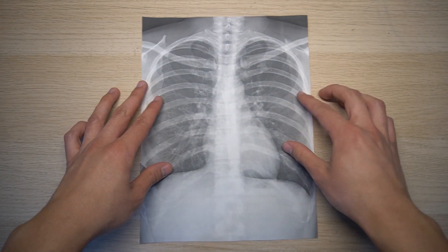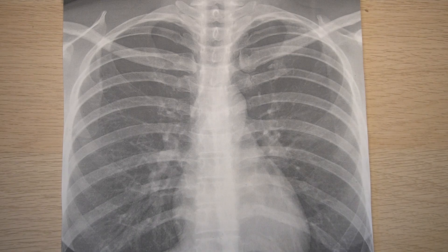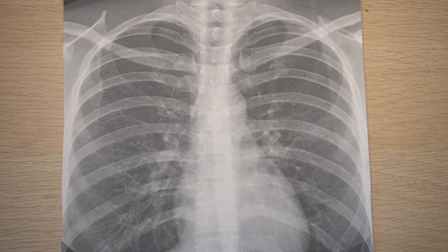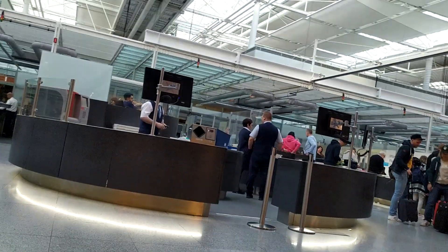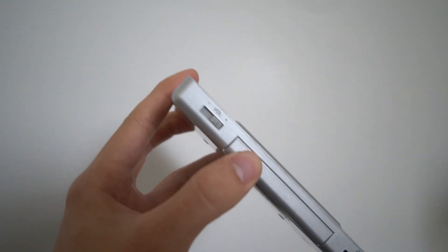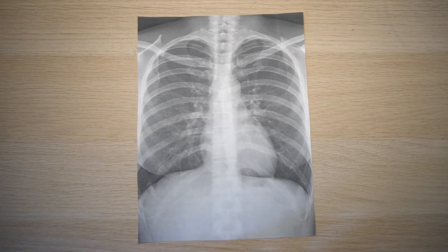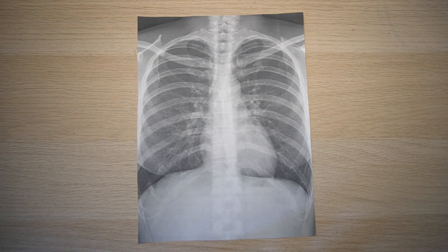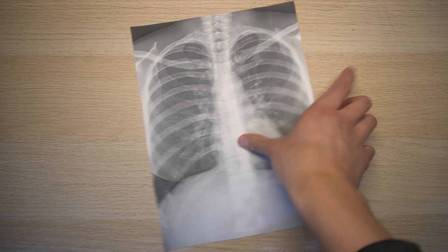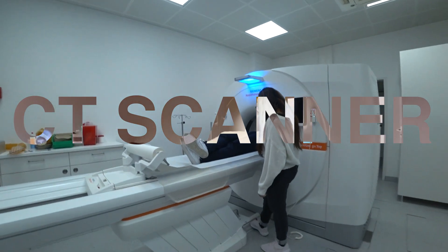At first thought, why not an X-ray? Those images you see of your bones, or inside airport bags. But all the components are tightly packed together — how would it even be possible to understand with a single 2D image? If there would be a way to see it in 3D... a CT scan.